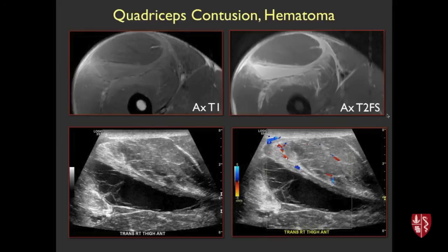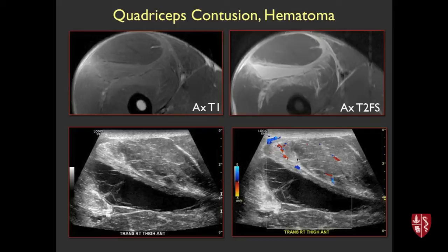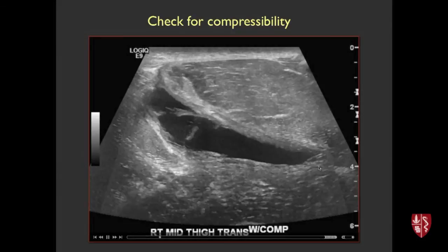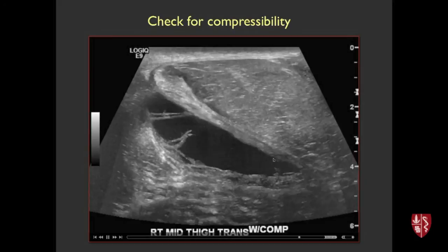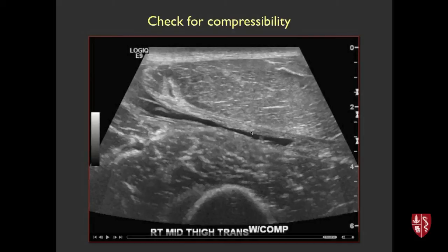Here's an example that was successful, though. This was a Stanford football player who had taken a blow to the quadriceps region. T1-weighted MRI and T2 show all this fluid between the rectus and the vastus musculature. Ultrasound without and with color flow shows some regional vessels but no internal flow. One trick to determine if something is drainable: just take the probe and mash on the skin. If it collapses like this, it's clearly a pocket of fluid likely to be drainable. With something like this, we can pretty easily put a needle in and drain the majority of that collection, really reducing the pressure.